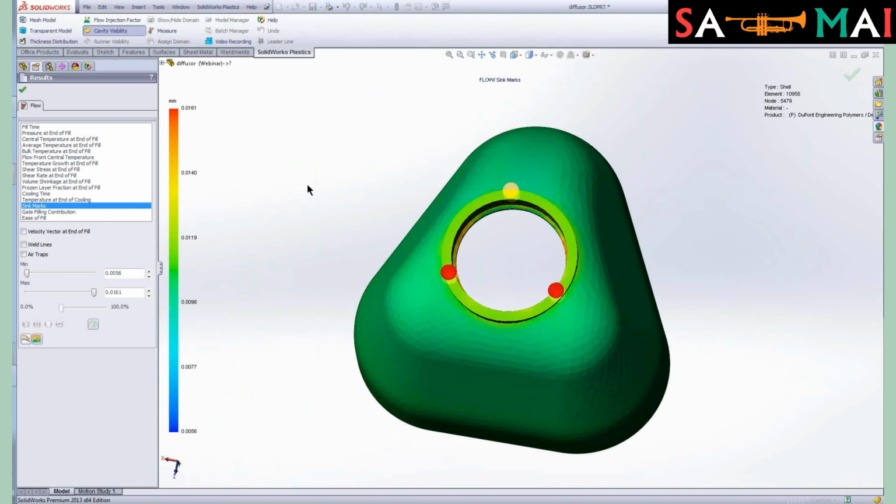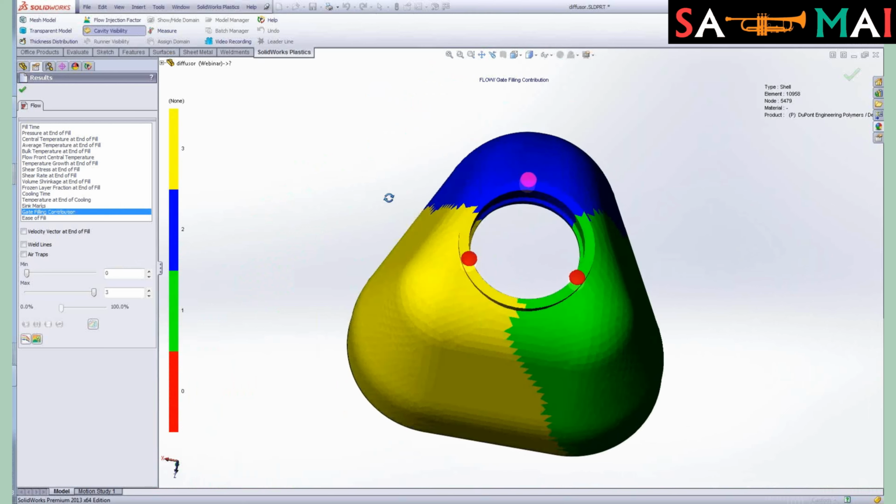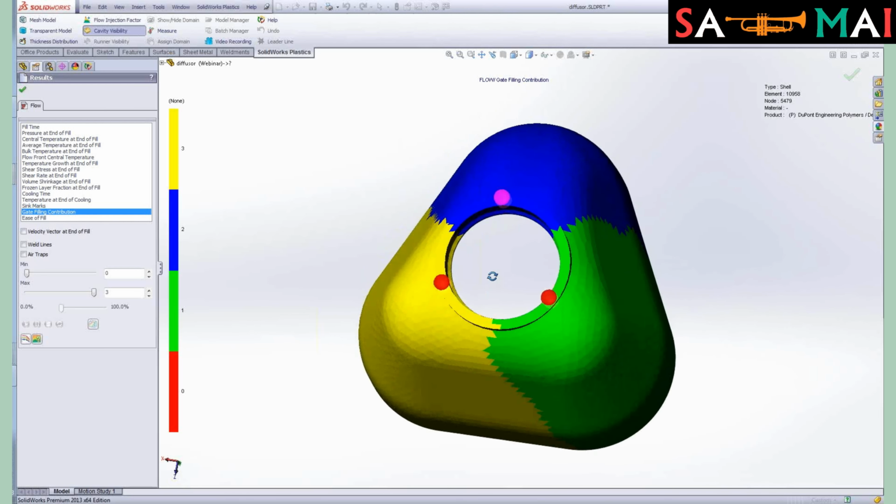The nice thing about using multiple gates is we get this gate filling contribution. So we can see gate 1, this gate here, this is the volume of the part that's filled by gate 1. The blue is the volume of the part filled by gate 2, and then 3 obviously by gate 3.